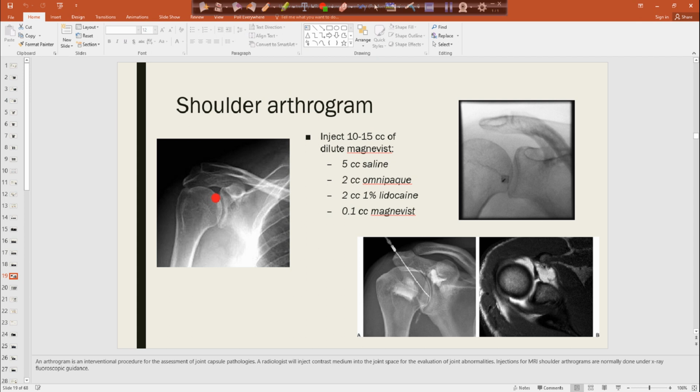Okay, I see a little fault in that workflow. What if they did all that and then they're claustrophobic? What if they did all that and they don't even fit in the coil? It's a very good point. So a lot of places should be doing this type of workflow where the arthrogram patients should visit MRI first, fill out your screening form. If they indicate that they're claustrophobic, do a dry run. If they're too big to fit the coil, find a way to work around that.